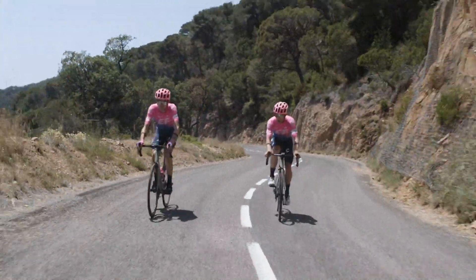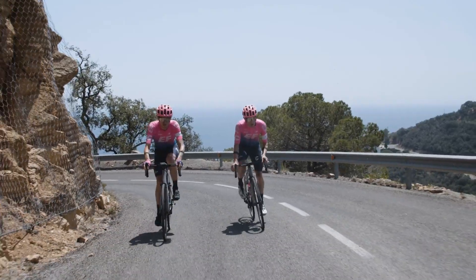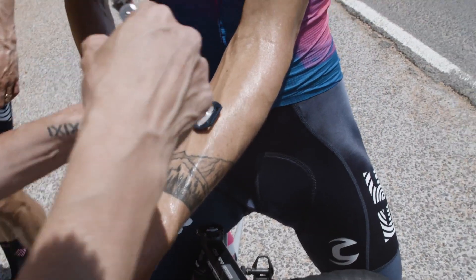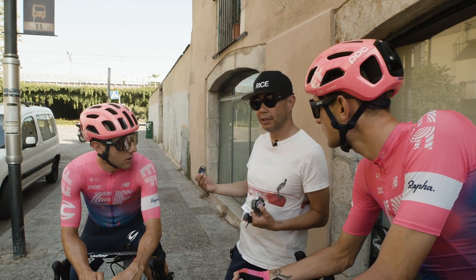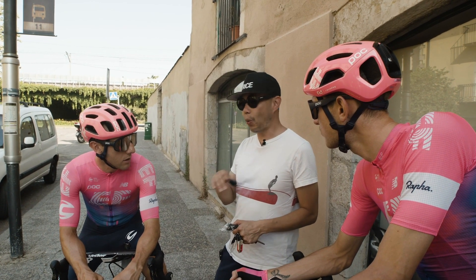Essentially we're going to put it on your forearm. It forms an airtight seal. I'm going to take some tape and basically tape it on there, and we'll probably do one forearm each so that we get two samples. After you're done with that 10-minute effort, I'm going to collect the samples, put them in your individual bags, come back here and analyze them, and we'll know how salty your sweat is.